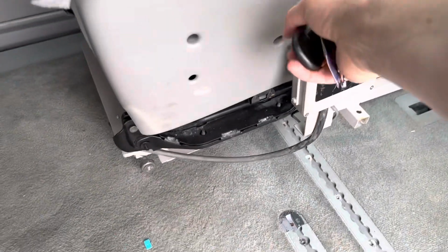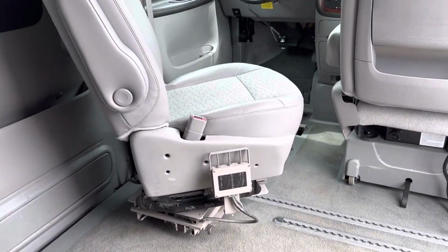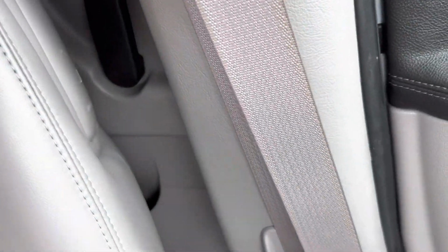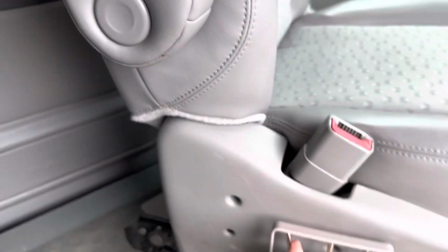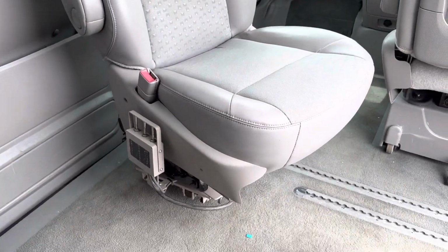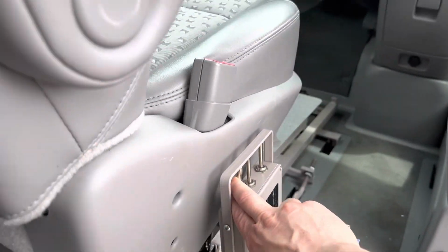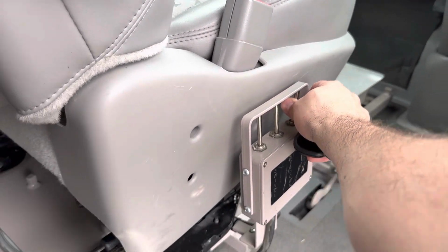So we move this all the way back, and then we can swivel the seat. You can go a little bit further than that as well. Just some adjustment on the seat itself here. That way it doesn't rub the interior panels. So that's the limitation of the movement there. So you can park the wheelchair user here, transfer over, and then slide yourself back into place. And then move this forward.